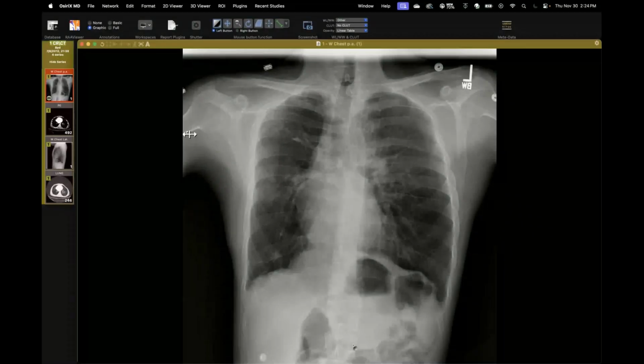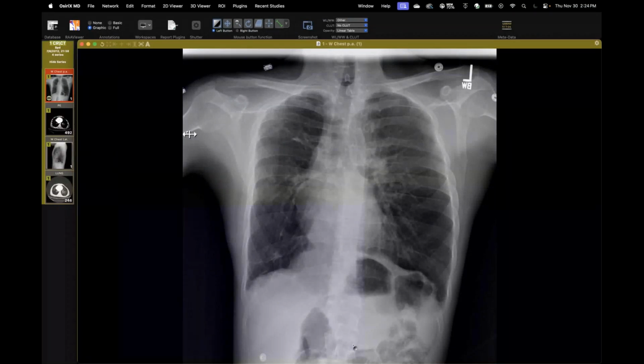All right, so this first patient is a young man. You can see my screen, I hope. It says it's still sharing. Let's see. There we go.